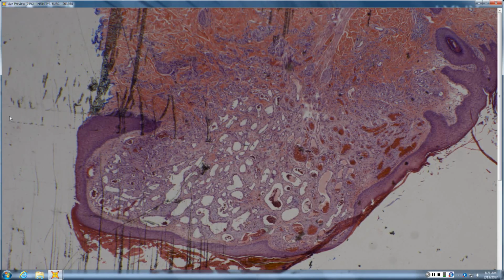It's a lot of blood vessels in the superficial dermis. Like a cherry angioma or angiofibroma. Cherry angioma, angiofibroma. How many of those have a collarette?